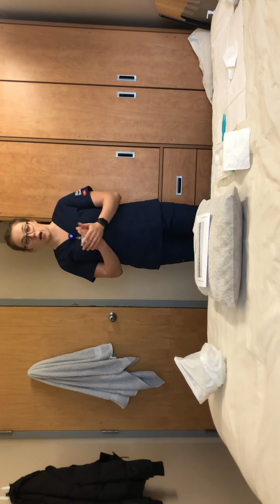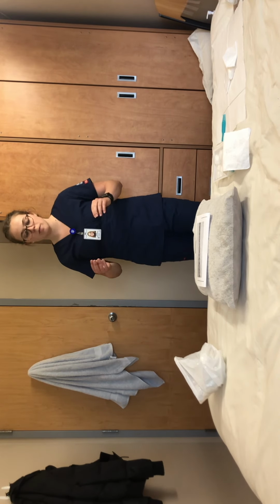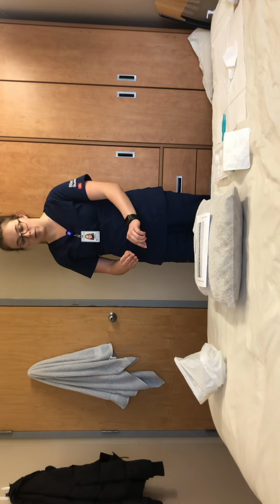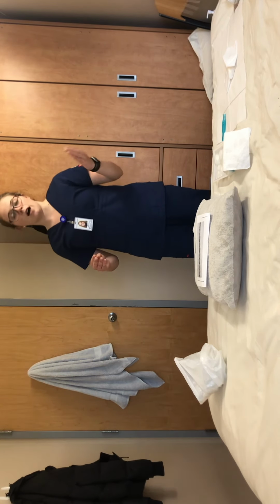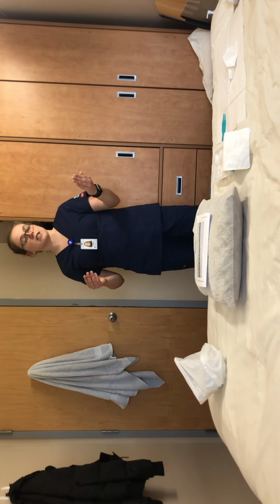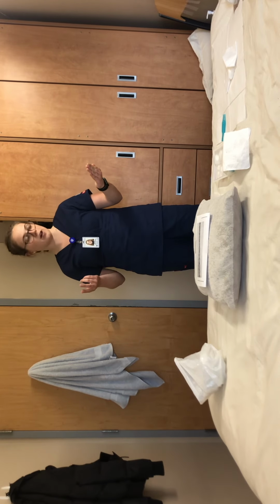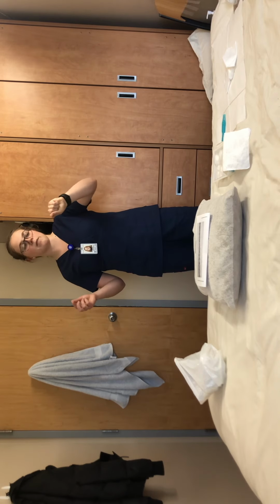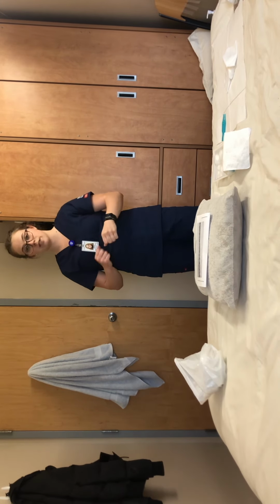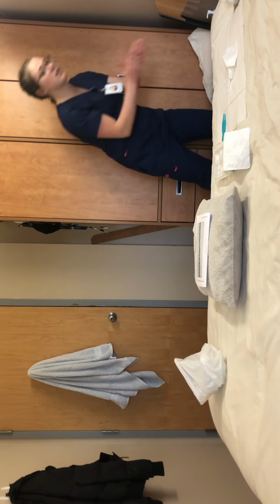And then we would be moving on to removal of the dressing. So what would happen was I would properly don gloves. I would do any other PPE necessary before we begin the procedure. Then I would stabilize the skin and remove the tape surrounding the incision. And then I would remove the pad, the dressing, and I would assess if there is any drainage, if there is any color, or if there's any odor with the dressing.